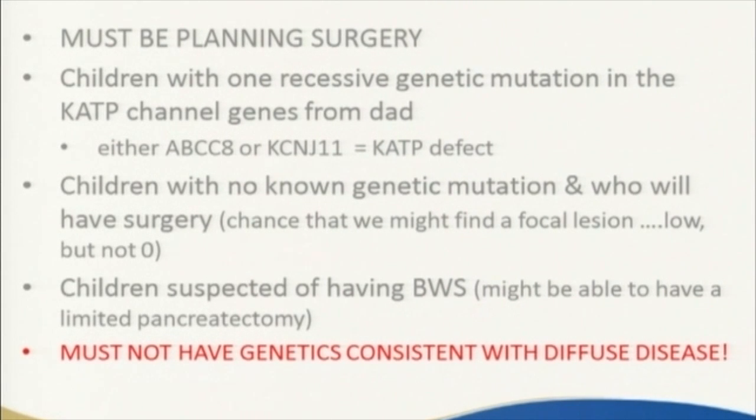Now, we will scan patients where no genetic defects are found, and some of those patients still have focal disease. So we understand they may have the genetic defect only in the pancreatic lesion, but not in the blood. So we do scan patients that have no known genetic mutation. But the patients that have diffuse disease by genetics, we do not enroll in the study.